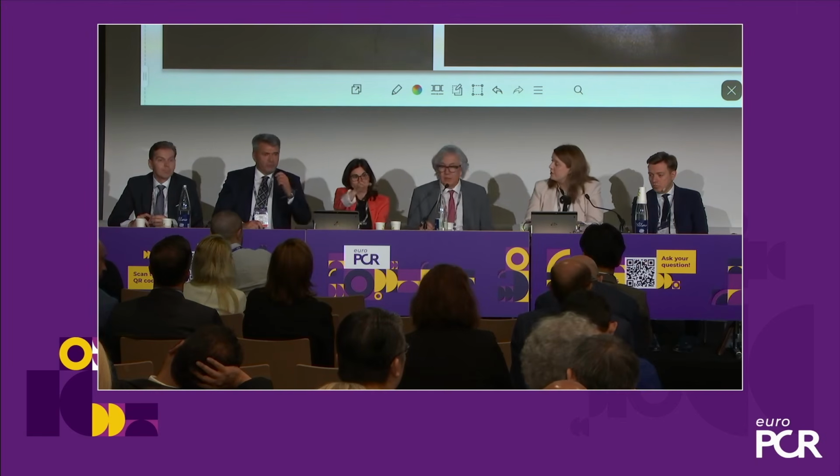We are doing the protocol on the understanding of the DCB, and once again, we don't use so much the angio and contrast. We use the OCT, and we do the 3D modeling of OCT and augmented reality pictures like holography to see the channels created by balloons, which are safe, which are not safe. So we are going into details, but once again with three-dimensional digital modeling and not angiography, to better understand what you said, the propagation of dissections and channels. Yeah. We have one more question probably.